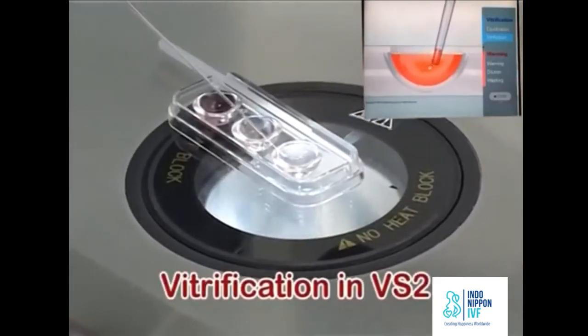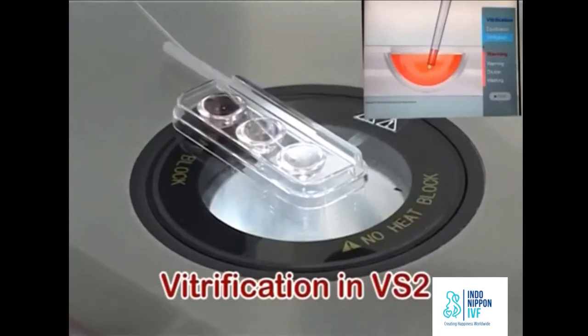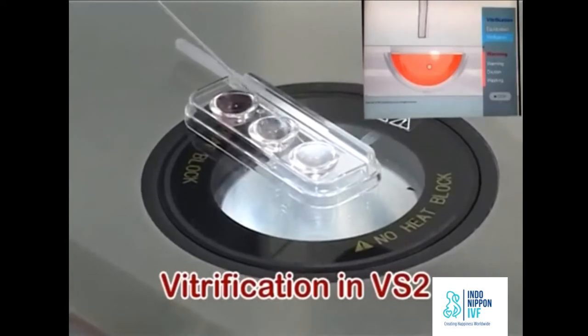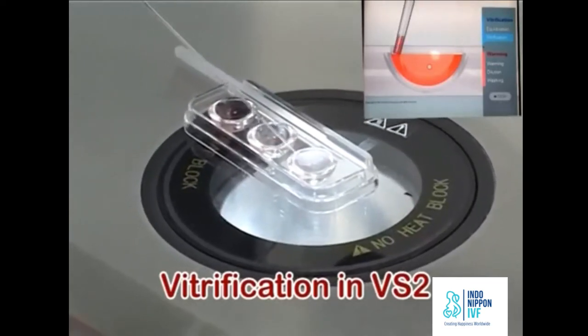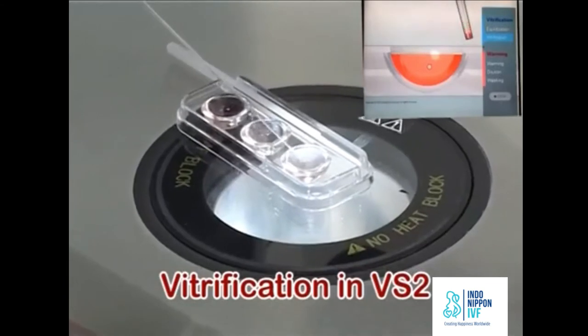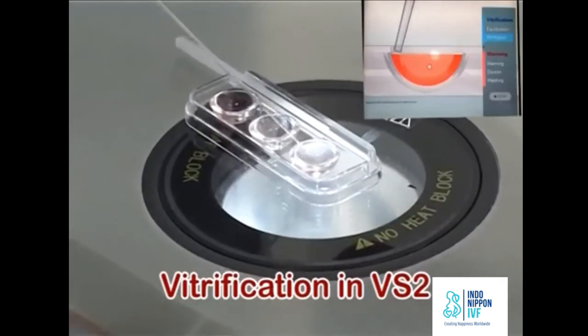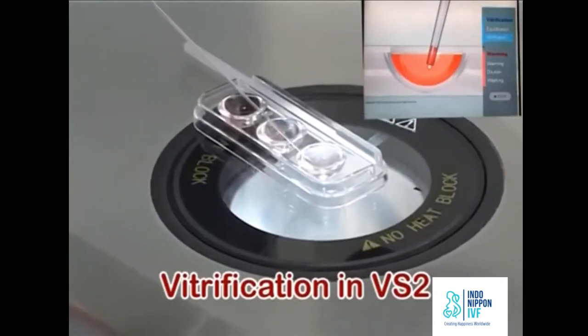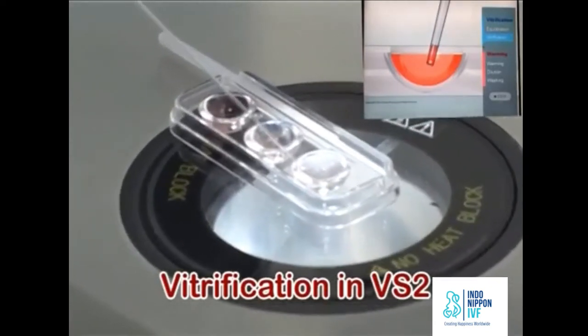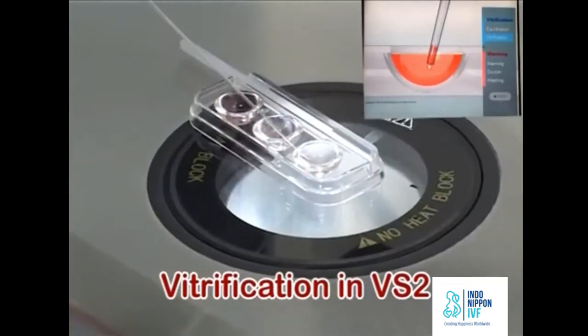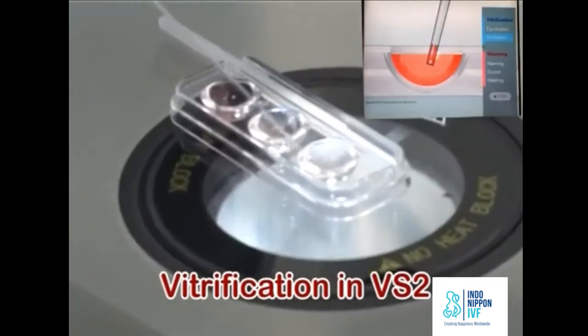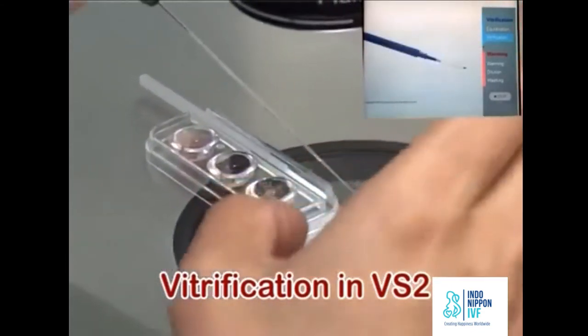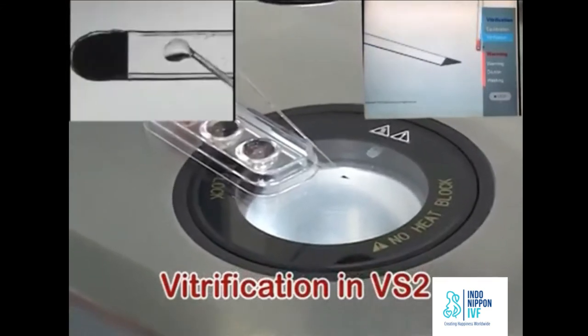Transfer the oocyte to the middle depth of VS-2 with minimal amount of VS-1. Discard the remaining VS and aspirate fresh VS-2. Expel VS-2 around the oocyte and mix the solution around the oocyte to exchange the remaining previous solution. This step is completed when the flat shrinking of the oocyte is absorbed. Aspirate the shrunk oocyte with minimal amount of VS-2 at the tip of the pipette. This entire step in VS-2 should be completed within 10 to 20 seconds.